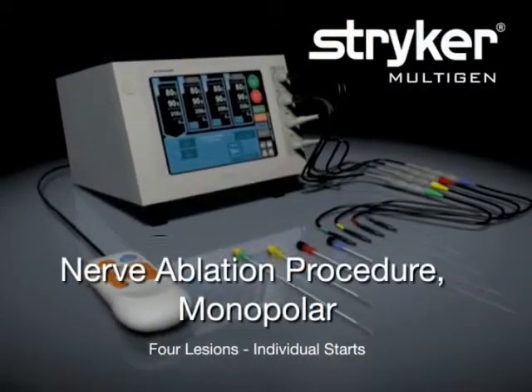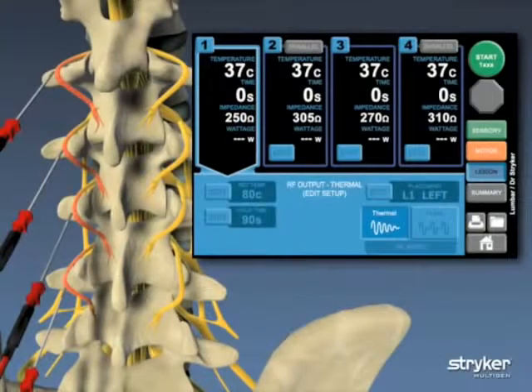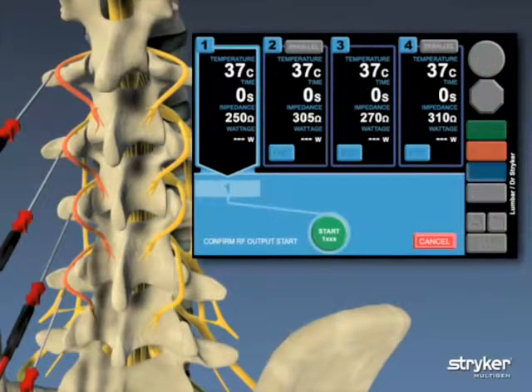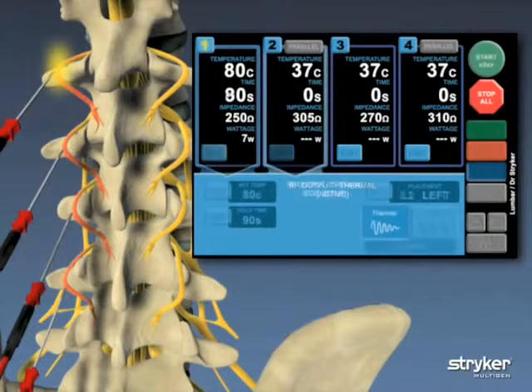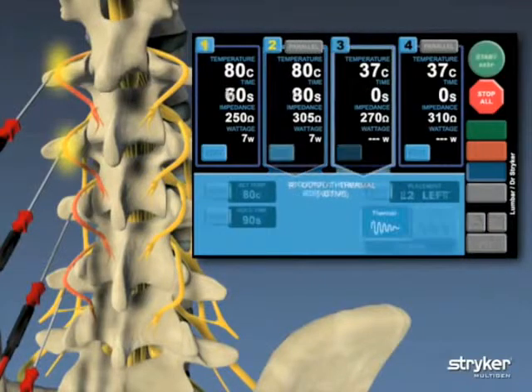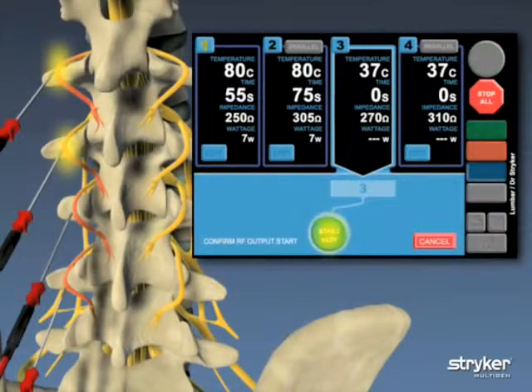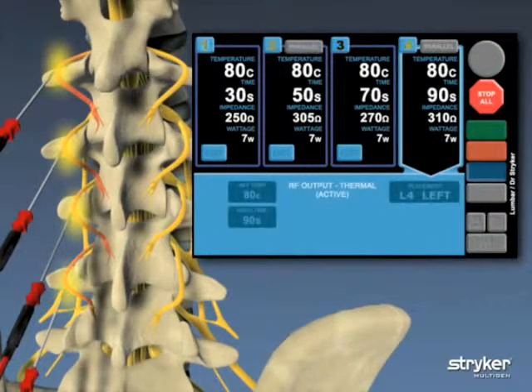MultiGen also allows either thermal or pulsed radio frequency with individual starts. After the sensory and motor tests conclude, the user goes to the lesion screen, which defaults to the first needle placement, and presses start. The user confirms they are ready to begin by pressing the start button a second time, and the procedure begins at the specified location. These steps are repeated for each needle placement. The user can wait for a lesion to finish before starting the next, or can use a staggered technique and begin at the next location while the previous is still burning.